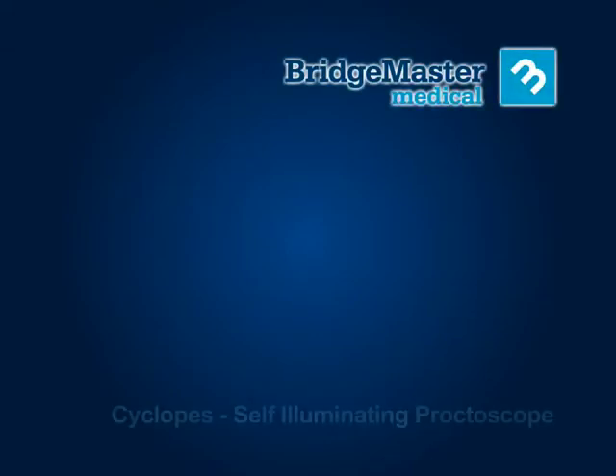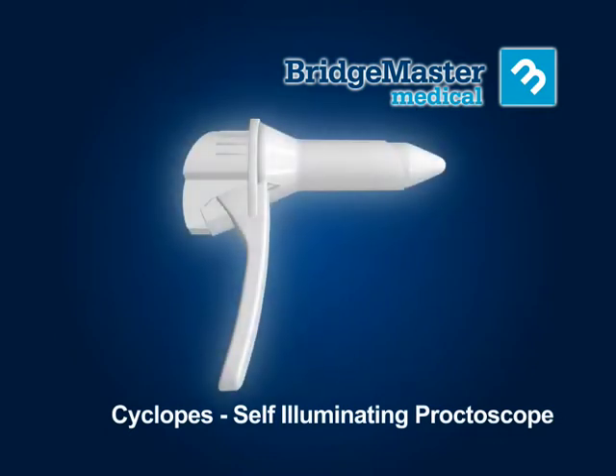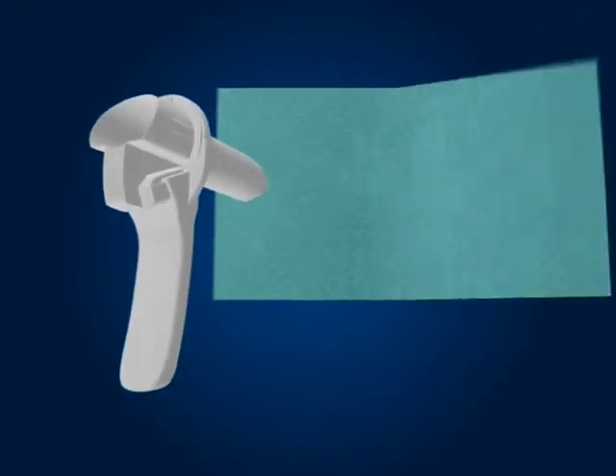Bridgemaster Medical introduces the Cyclopes, one of the first fully disposable proctoscopes with its own integral light source. Cyclopes should reach you in a sterile condition; however, it is always best to check the packaging for any damage before use. If the packaging is damaged, discard the instrument; otherwise, open the packaging and transfer Cyclopes aseptically into the sterile field.